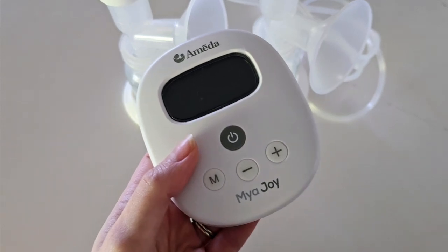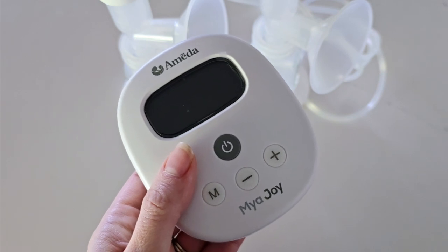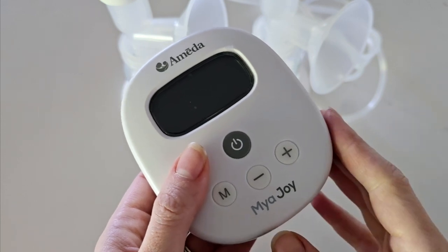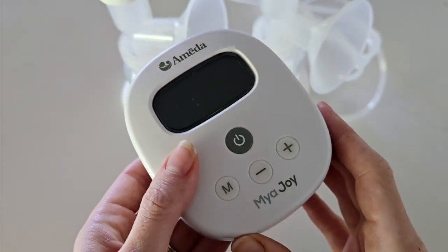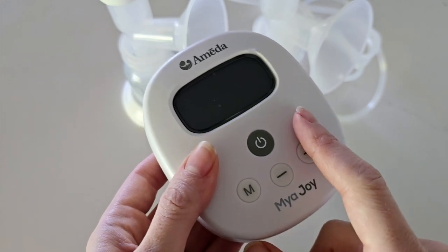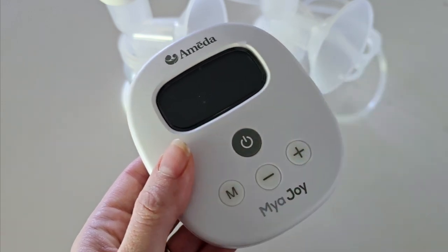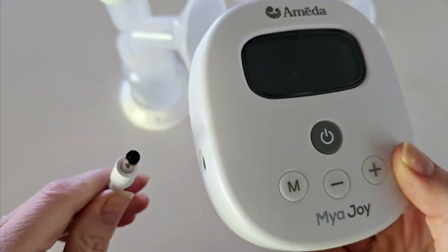In this video I'm going to break down the different components, settings, and how to use your Mya Joy breast pump. This is your Mya Joy pump motor — it creates and drives your suction. It is operated by four buttons and you can monitor and track your pumping session via the LED screen.